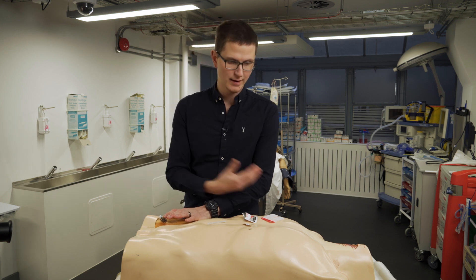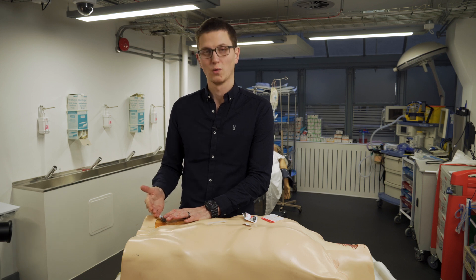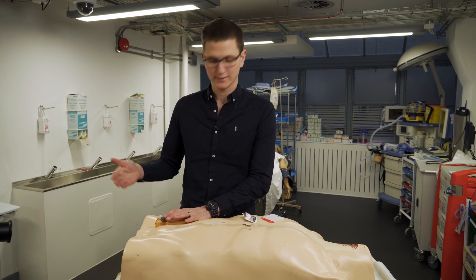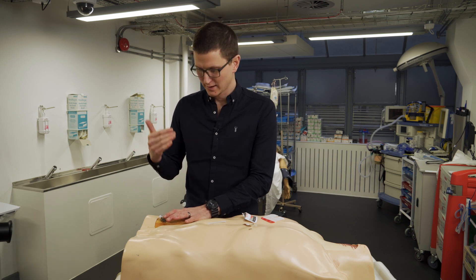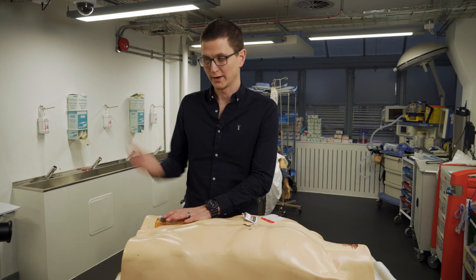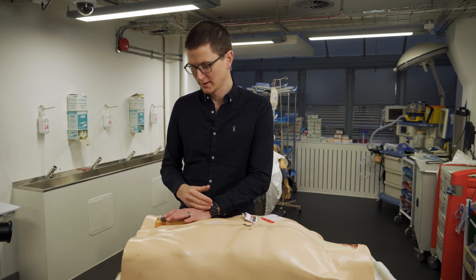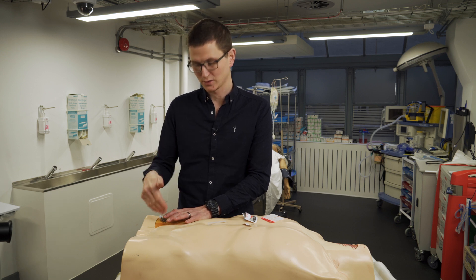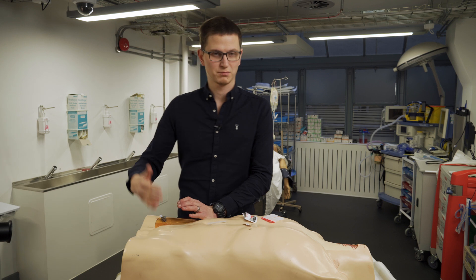As I said previously with the jugular vein, you want to make sure there is no high pressure blood coming through this. Because if we attach our saline and we suddenly have blood traveling back up the line — which I've seen — it tells us we are in an artery. You're going to see it pulsating back up the IV line, which tells us we are in the incorrect place. Now we need to try and compress this, which is a challenge because it's quite deep. That's kind of why we don't really do this very often anymore.